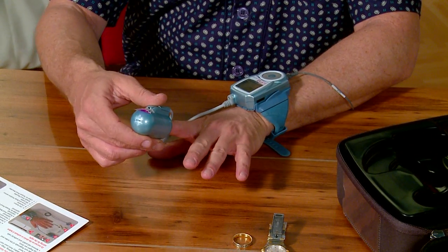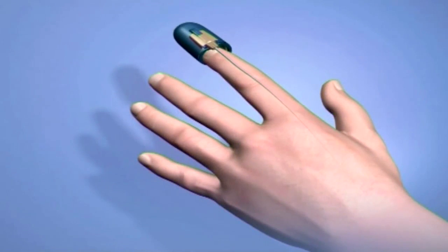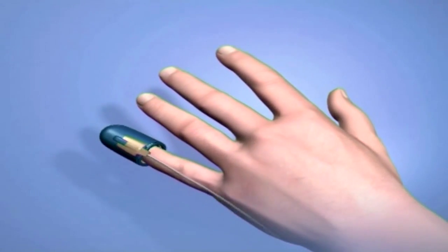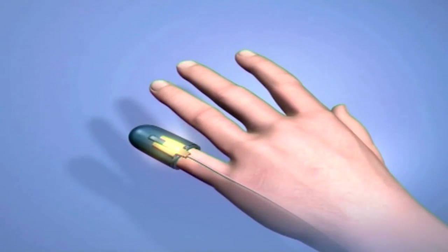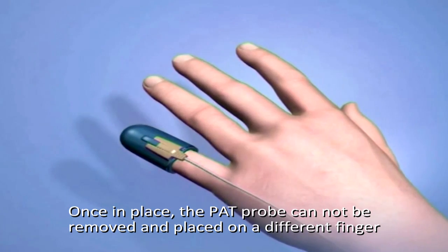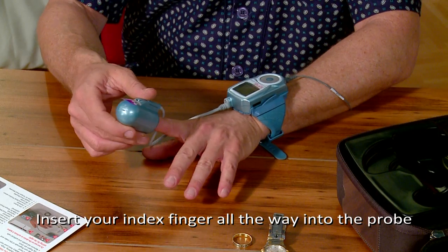Place the PAT probe on your index finger. If your index finger is too large for the PAT probe, you can choose another finger that fits better — for example, your pinky. Choose carefully, as once in place, the PAT probe cannot be removed and placed on a different finger. Insert your index finger all the way into the probe.